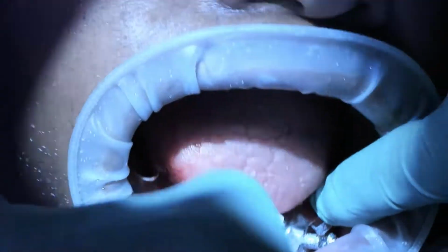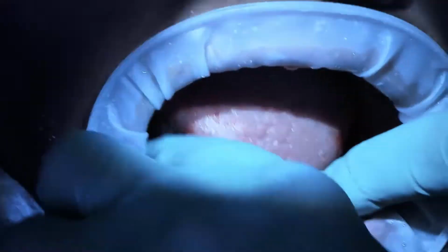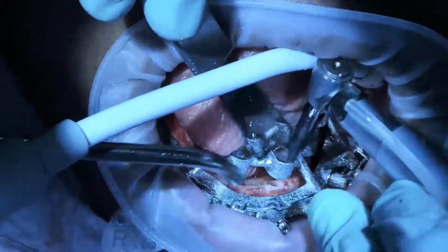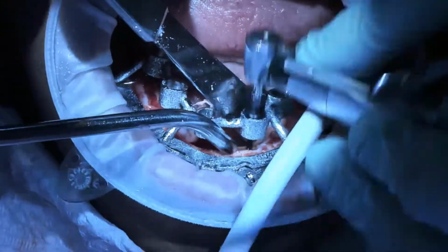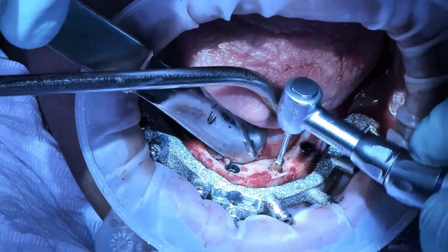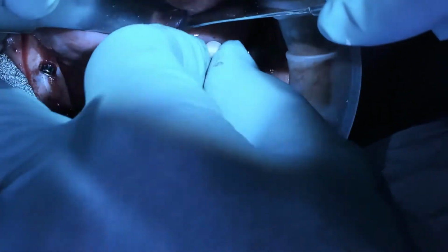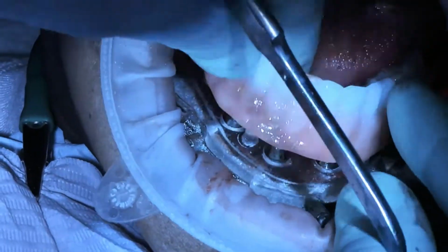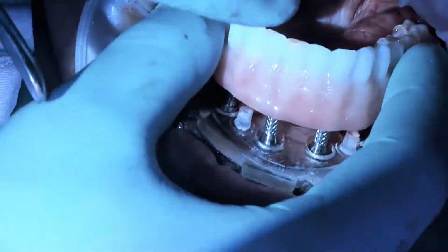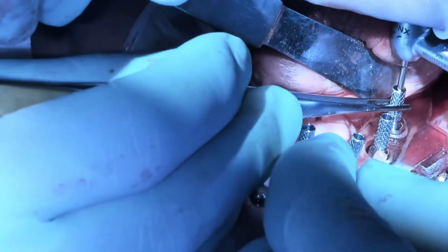Now that the mandibular fixation base is in place, the bone is reduced, and the normal protocols are followed for Chrome, which is bone reduction, try-in of the carrier guide, and then the abutments and temporary cylinders are placed with the carrier guide in place, and then the prosthetic is picked up in occlusion, and the case is finished.